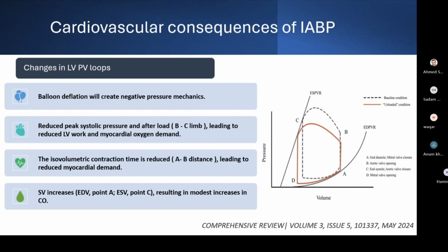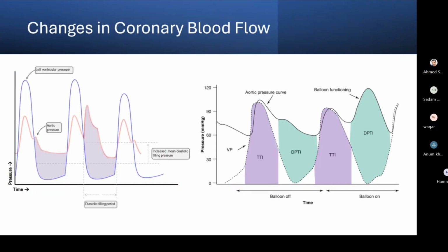Actually, if I can say something on this one, what I'm getting from Bakar is that this diastolic pressure in normal circumstances occurs when the heart is contracting without a machine. If the diastolic pressure increases, for example in high blood pressure when it crosses 100, then that will increase the afterload for the heart, and that will be a lot of struggle for the heart and may cause MI.